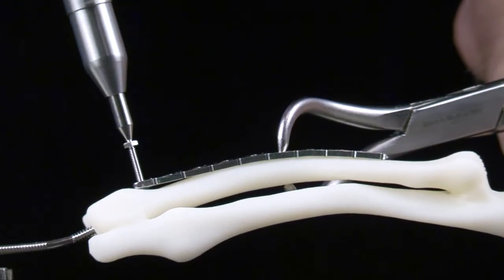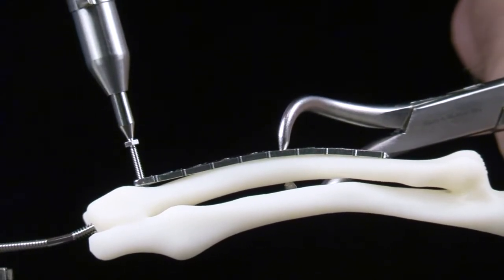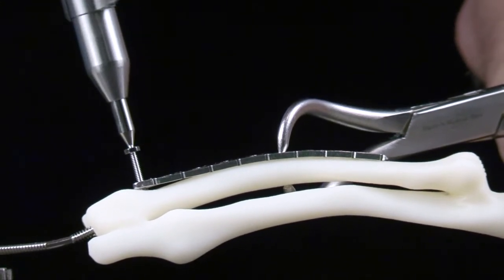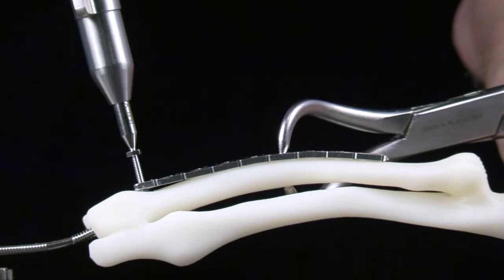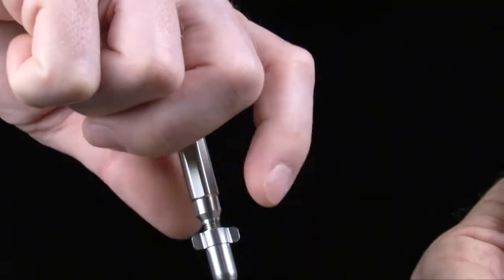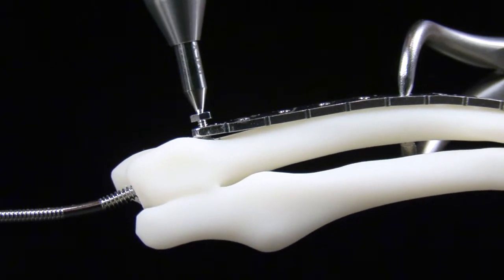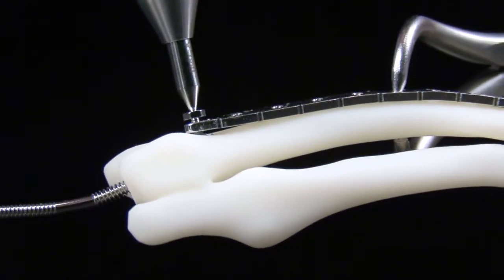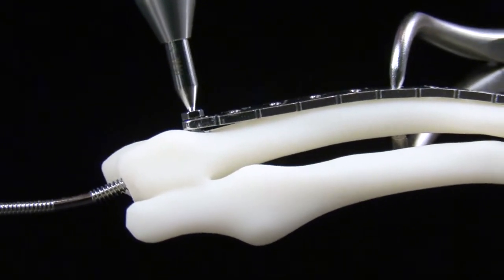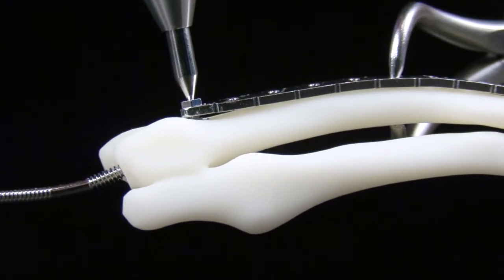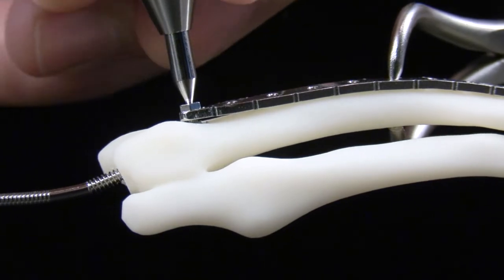If the screw does not advance easily through the plate, then remove the screw and reinsert, paying close attention to achieve a perpendicular screw orientation relative to the plate. When the head of the screw contacts the bone plate, further advancement is not necessary. Additional screws are typically placed to stabilize the bone plate construct prior to removing the integrated screw drive shafts.